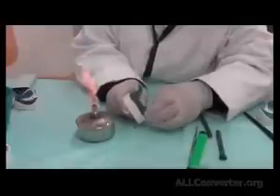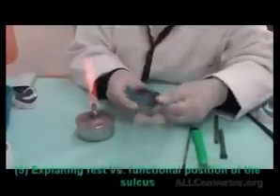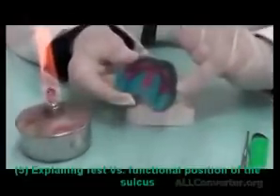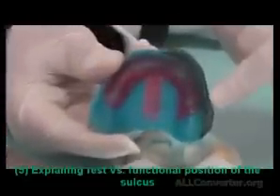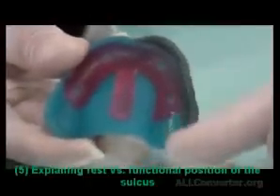Now why do I border mold correctly? Because I had some space between the tray and the sulcus, so there is space for green stick. So it will border mold beautifully. Once more, if you look closely, you can find that the sulcus roll is recorded in the impression, it's a continuous roll from the beginning till the end, where it ended. It's no longer shiny, it's matte, and that means it had touched the depth of the sulcus. So this is fully recorded now.